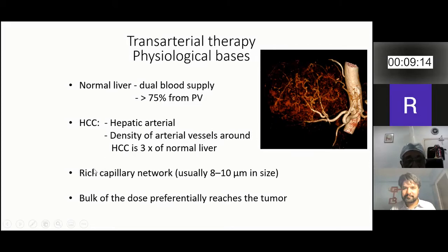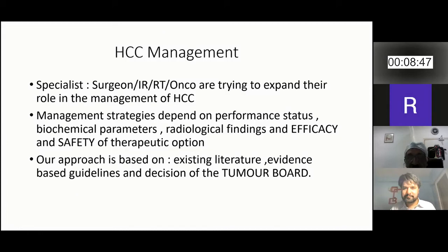So this is primarily the approach. The tumor has a rich capillary network, and these microspheres go deep into this capillary network and get deposited, causing radiation necrosis. So when you inject it, the majority will go towards the tumor because there is a preferential flow towards the tumor.